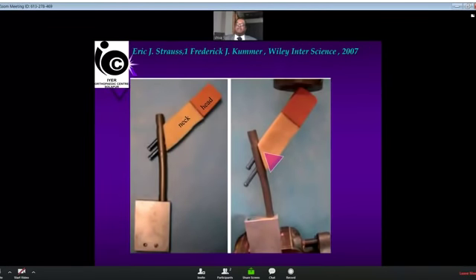Again, just a repetition of the same. If there is a gap inferiorly or void medially, when the head is loaded from the top and the inferior part tries to collapse more because the superior part is already touching, only the inferior screw tries to back out and jamming of the superior screw happens within the nail at the nail-screw interface, and that causes the superior screw to migrate inside. So if you have a medial void case, then definitely this is a problem that should be taken care of. How to avoid it, we will discuss subsequently.